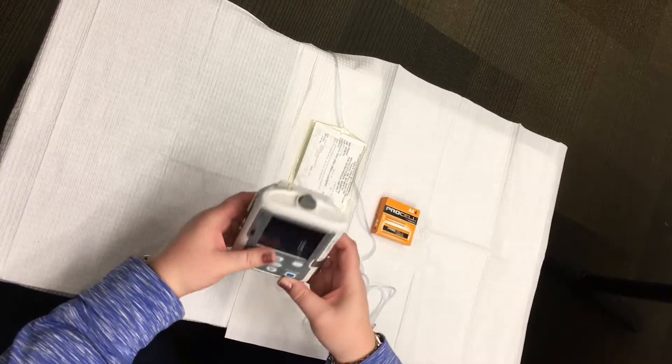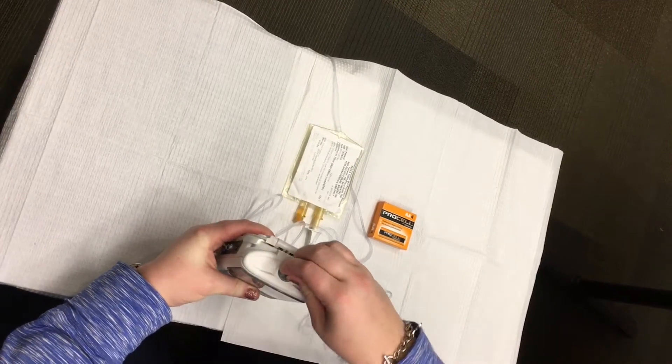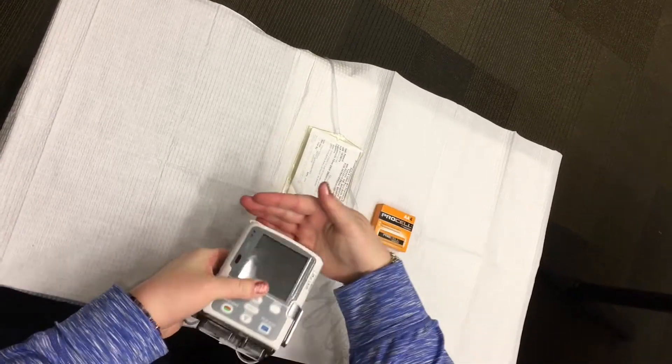Using your fingers or a coin, turn the knob on the battery door counterclockwise to open the battery door. Hold the pump at an angle to remove the old batteries and insert four new AA batteries.